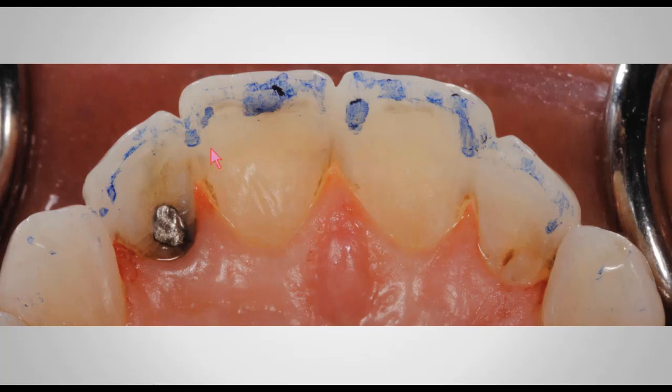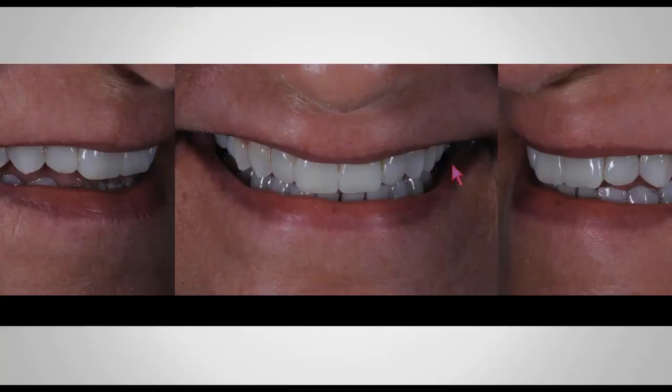And this is the contact that I'm looking at now in the photo, but I overlooked this premature contact when I was actually delivering the prototype, and I did not remove it. And I'll show you what happened a week later. But this is immediately after, and I want you to think about this.